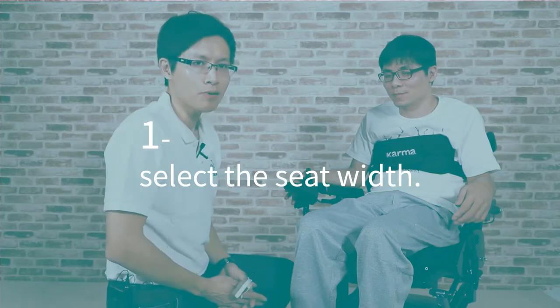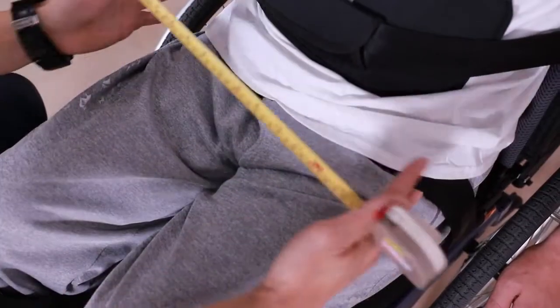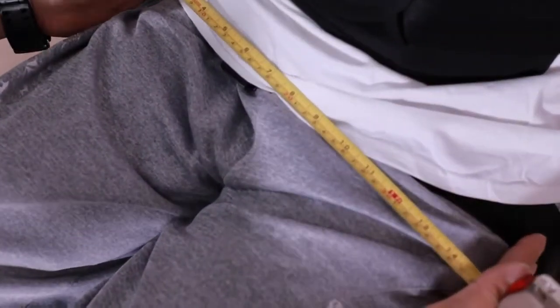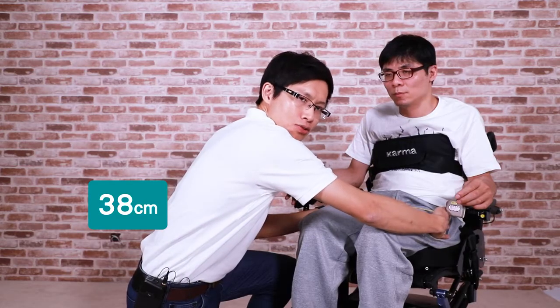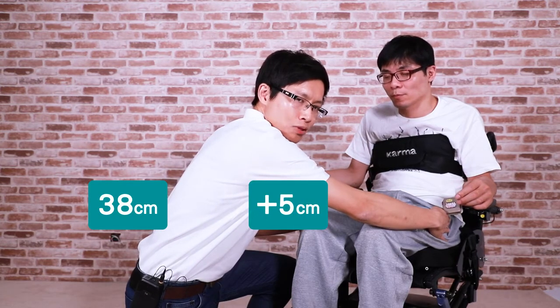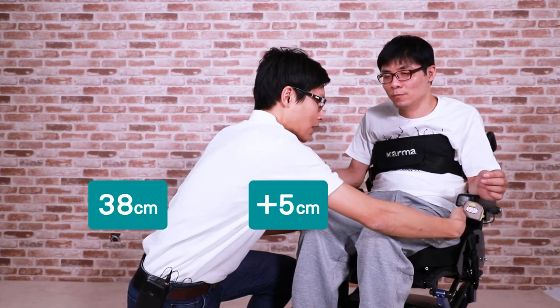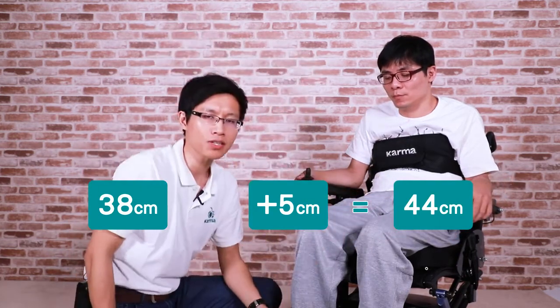To select a seat width, we must measure the widest part of the user's hip and thigh. Mr. Zhang's hip is the widest part of his base, which is 38 centimeters. Generally, we will add 5 more centimeters so the user can have a more comfortable sitting. Therefore, Mr. Zhang is most suitable for the 44 cm seat width.